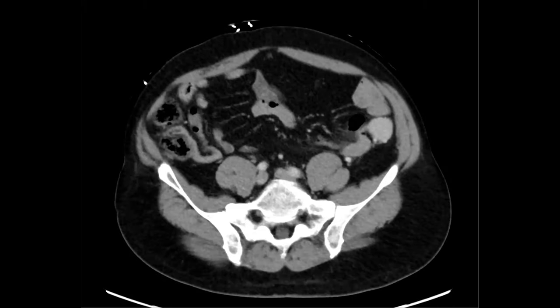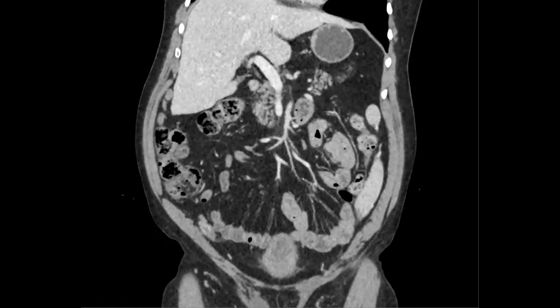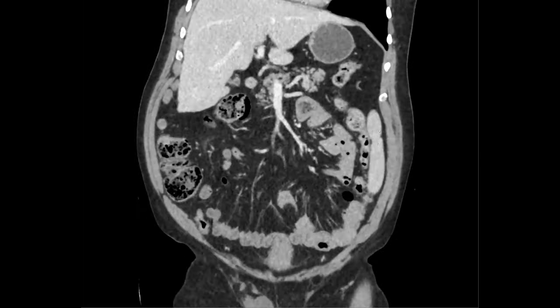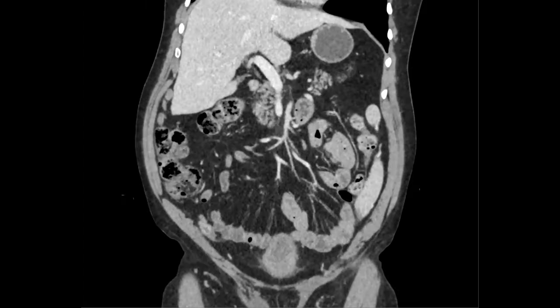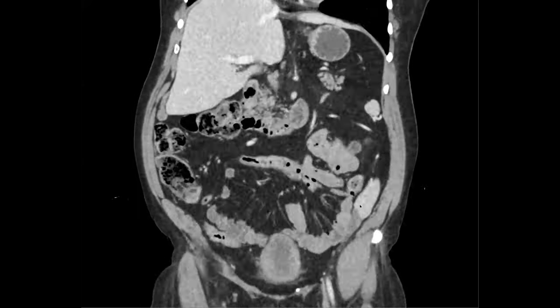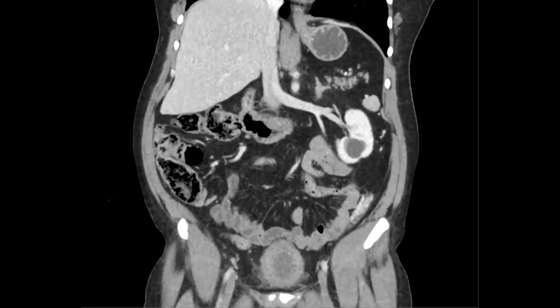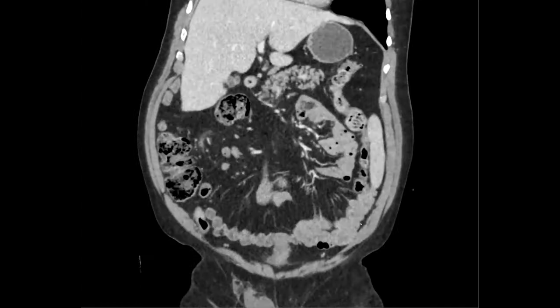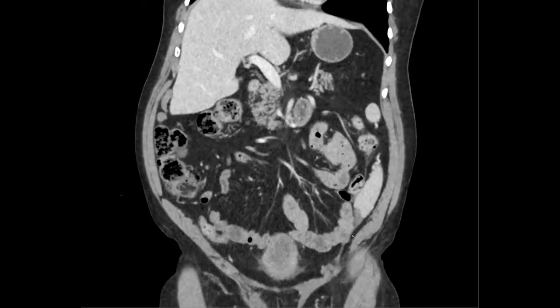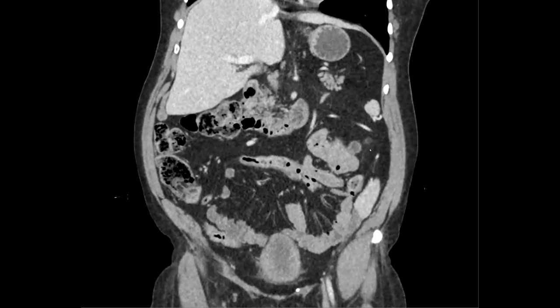Is it a testis? Which is the testis? The one which is up there. This huge, this is a testis? I'm thinking. Good, you're close. You can see that there's a vessel going from the spleen down to this thing. Yeah, so maybe an ectopic spleen or something. Uh-huh. And there's something else going on. What is this thing attached to the ectopic spleen?